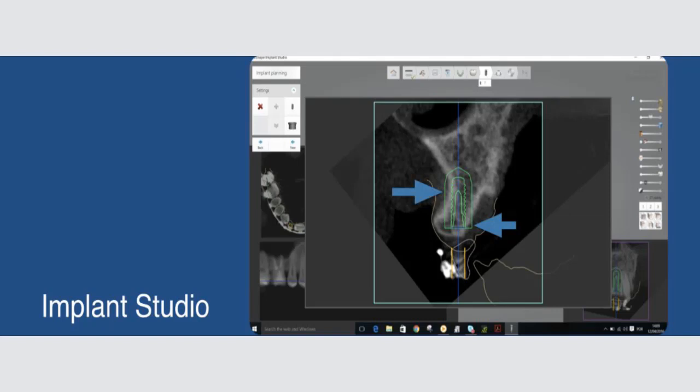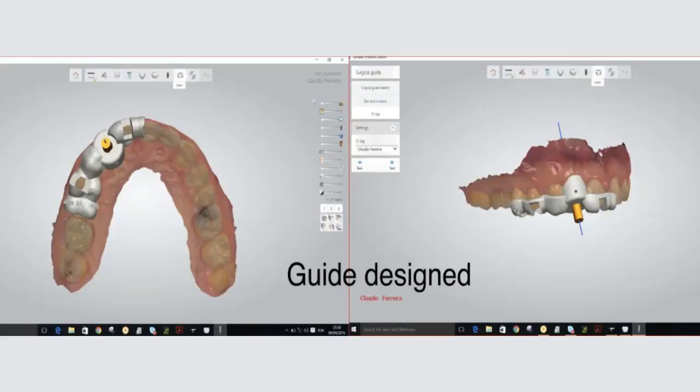So as I have a fenestration, I will need to graft it. That's why when I did the clinical evaluation of the patient, I knew that I would have a fenestration coming in, and then I would need to graft. And I would like to track down this grafting, how this graft has developed or evolved along the period of the healing process, and as the years go by, I would really track that.